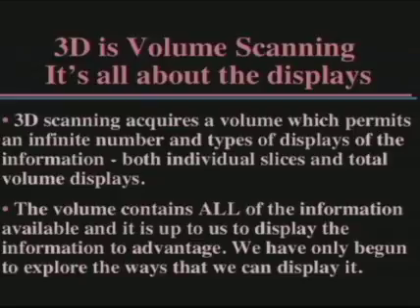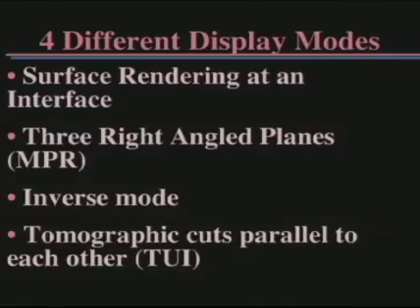You can either slice it and dice it, or you can render the entire volume as a surface, for example. But the volume contains all of the information that's available. And it's up to us to display the information within the volume to advantage so that we can show what we want to show. So we've only just begun to explore the ways that we can display the information within that volume.